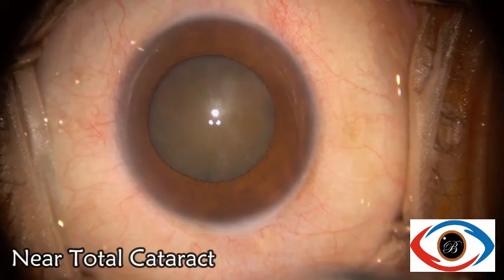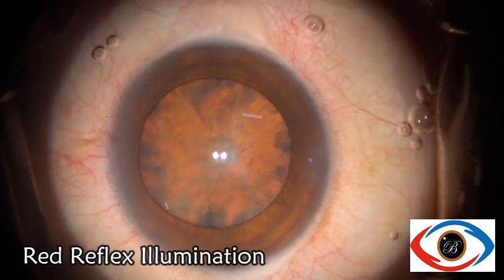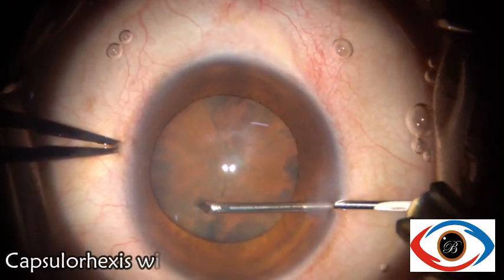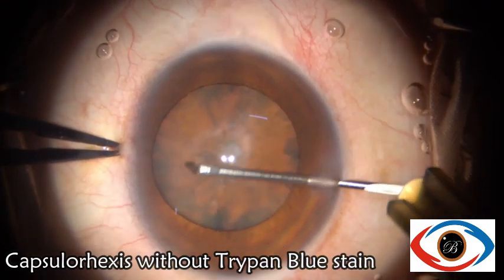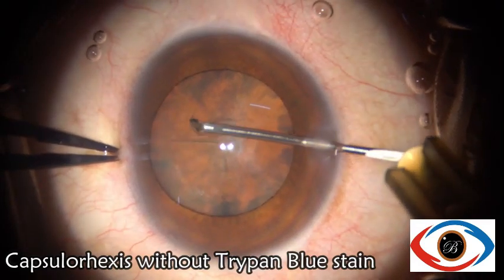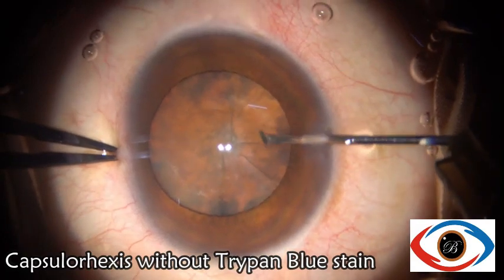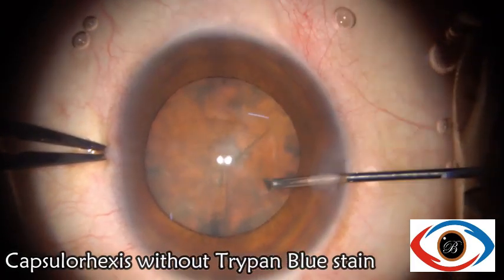In the first case of near-total cataract, we could perform capsulorexis without staining the capsule, as red reflex illumination provides excellent contrast which obviates the need for staining the capsule in such dense cataracts.